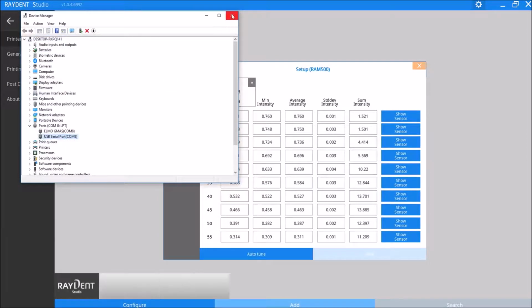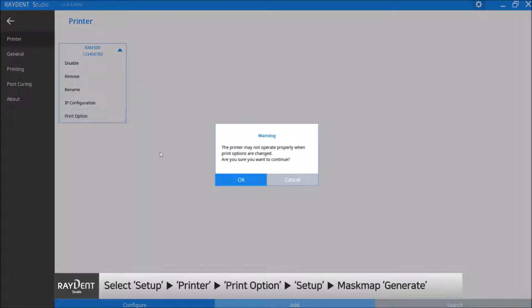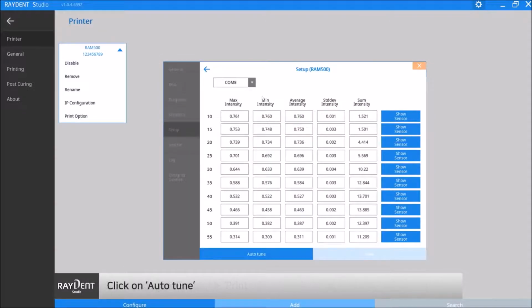In the studio software, click the setup icon on the top right corner and click on the printer and an arrow will appear. Click the arrow to open the menu and click the print option at the bottom, and click OK when the setting change warning pops up. And if you look at the menu on the left, there's Mask Map. Click on Generate and Auto Tune.